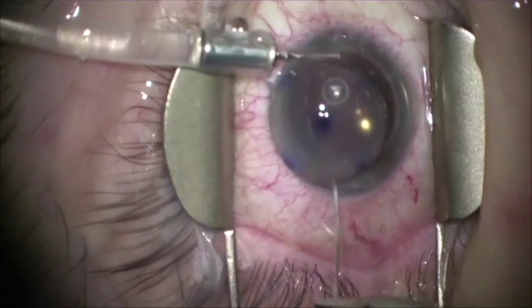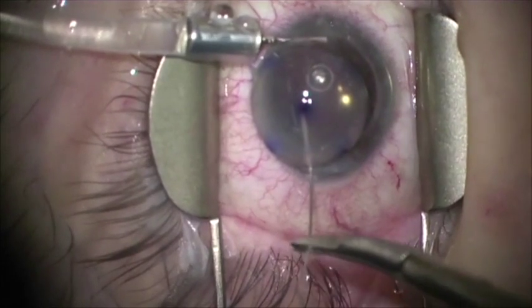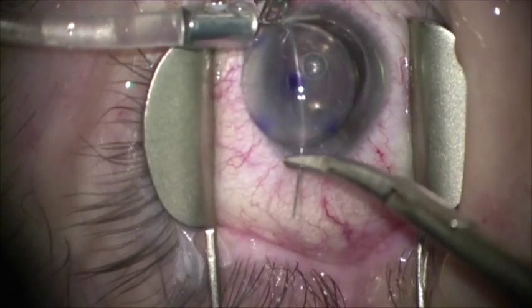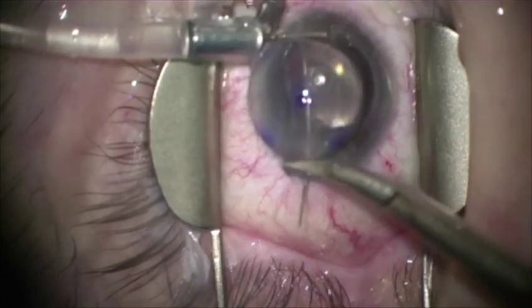If the suture is going to be left in place for a short period of time, like I sometimes do for an aphakic eye, then the spacing is even more critical.